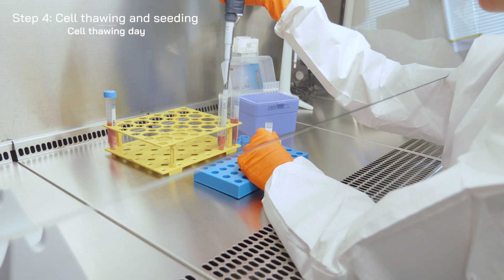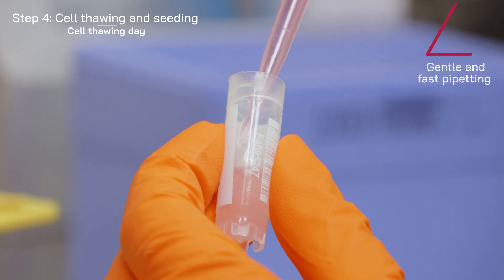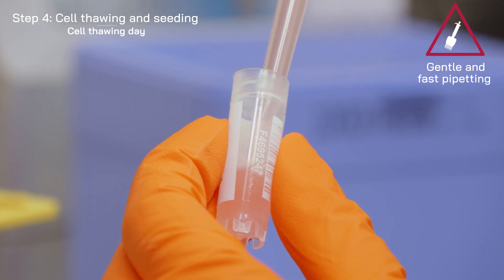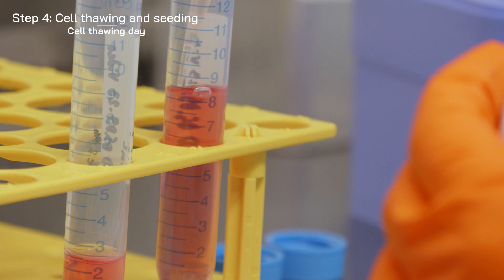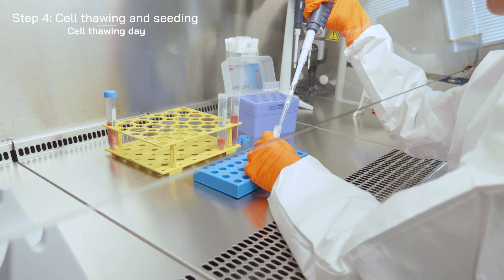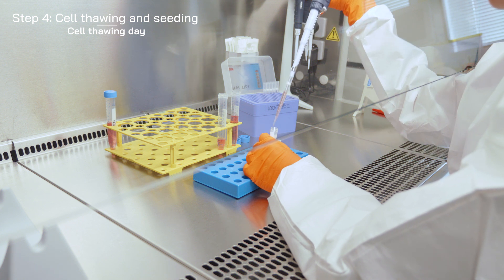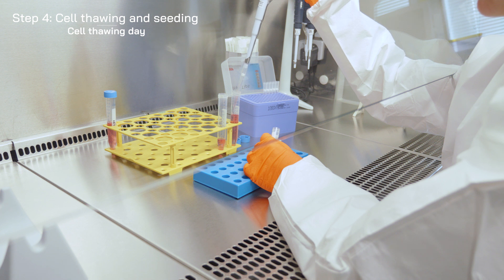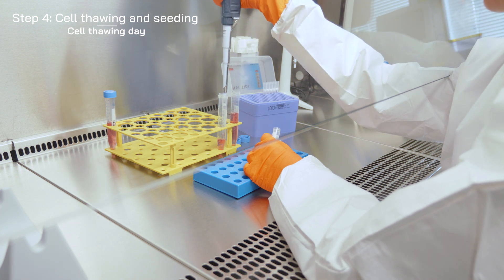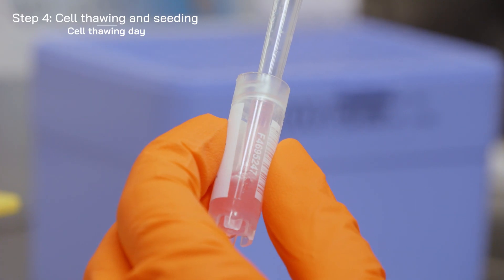Dilute rapidly and gently with 1 ml of warm medium to limit exposure of the thawed cells to the freezing medium. Gently transfer the cell suspension to a new tube containing 7 ml of warm medium. Rinse the cryovial twice using 1 ml of medium each time to recover all the cells.